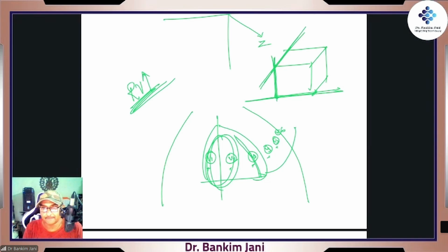You got that thing? If you say V1, V2, V3, then they are right, because you are watching the front surface. V3, V4, V5, V6, then it is like you are going on the side, that is the side where there is the left ventricle. Okay, you got it?